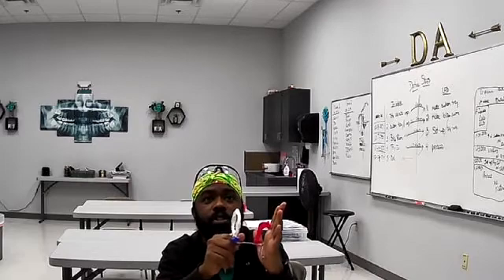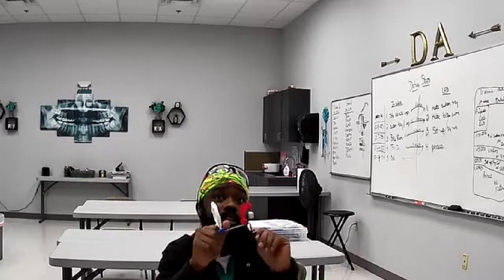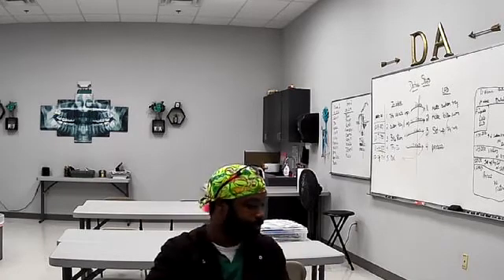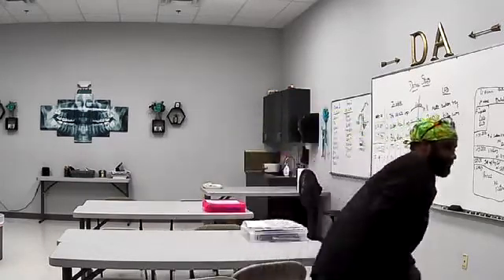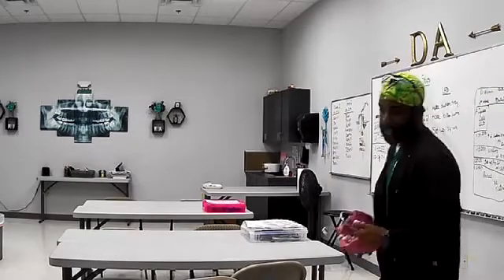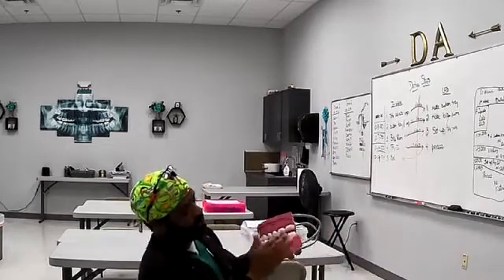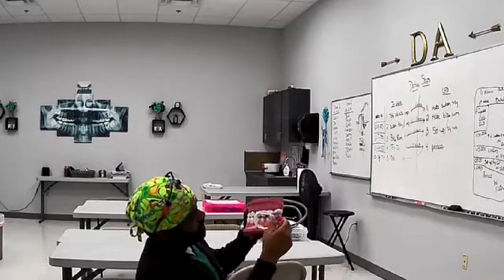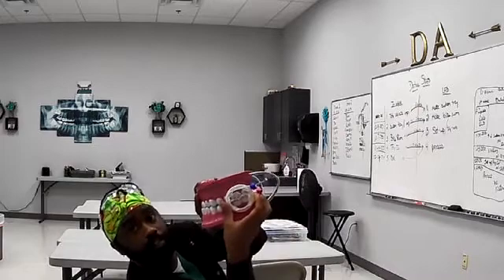Each bite wing captures the visible part of the upper teeth and lower teeth, as well as half of their roots and supporting bones. Meaning, if you're taking a bite wing of this, you will basically only see this part of the X-ray.